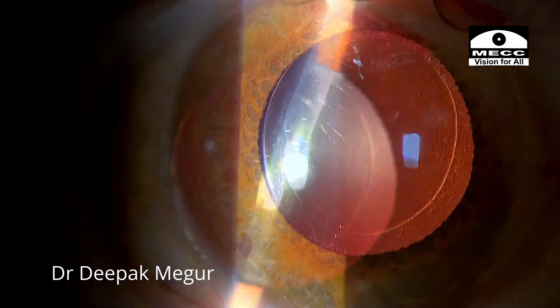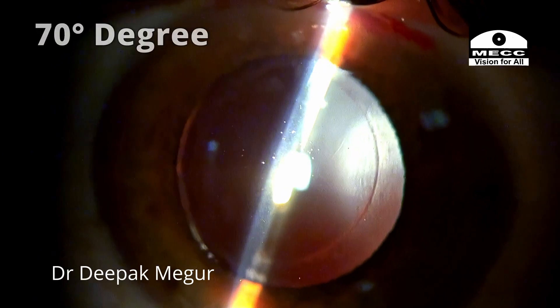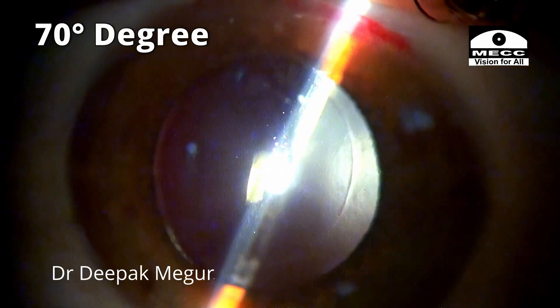The pupils are dilated and I am examining the position of the lens, just ensuring that it is exactly at the axis I intended — and it does seem to be in the same place, at 70 degrees. Well, I think he should be fine.